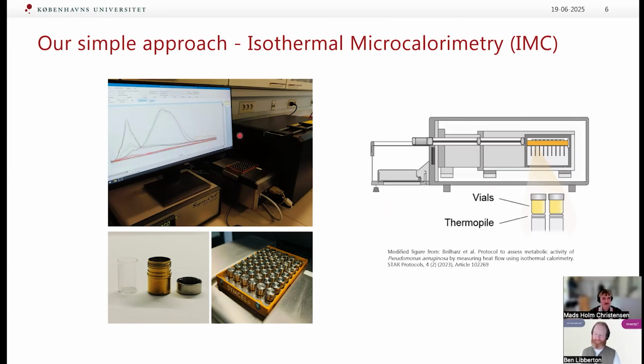So I wanted to use this technology to, first of all, detect bacteria fast from these types of infections, but also at the same time perform susceptibility testing. So you could get both measures more or less at the same time. And of course, you need to have some thresholds or ideas about when you say a bacteria is detected or when it is susceptible or when it's not susceptible to an antibiotic.